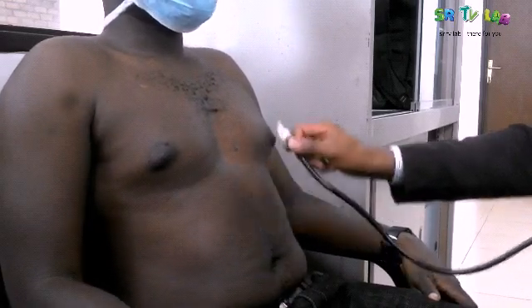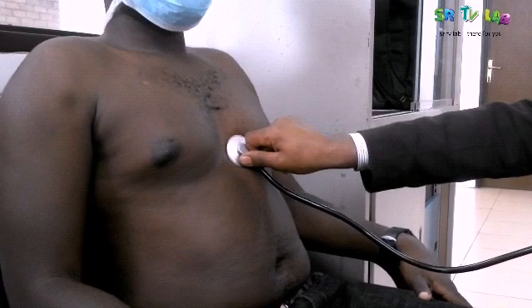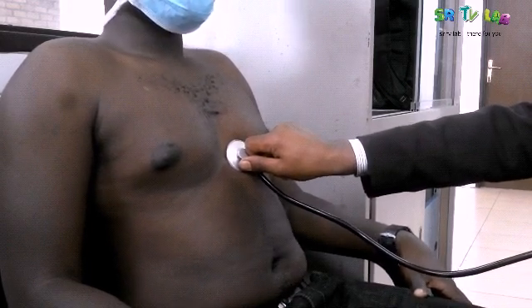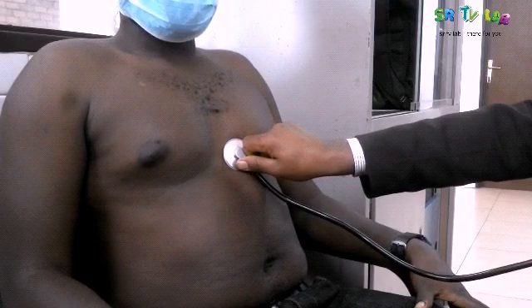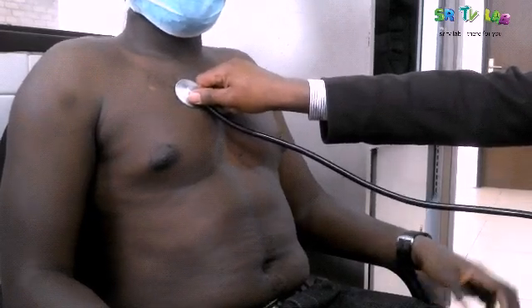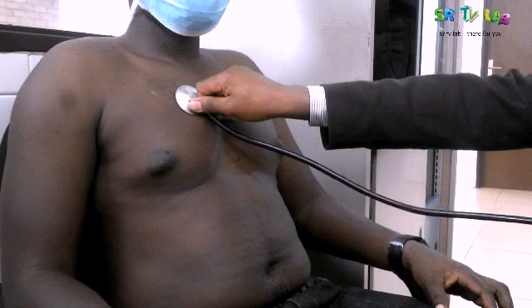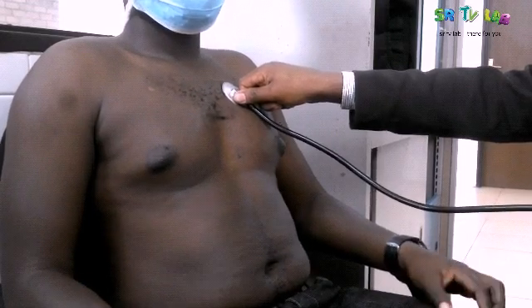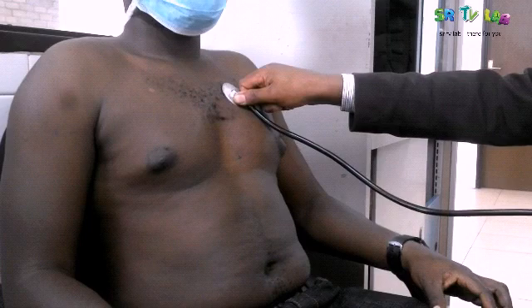The mitral area is at the fifth intercostal space at the mid-clavicular line. The tricuspid area is above the xiphoid process at the right edge of the sternum. The aortic area is at the second intercostal space at the right edge of the sternum. The pulmonary area is at the second intercostal space at the left edge of the sternum. Remember, you will hear both sounds at every auscultatory area.